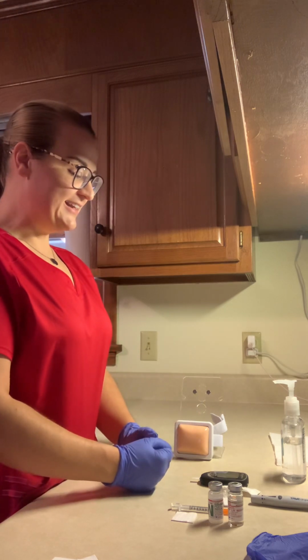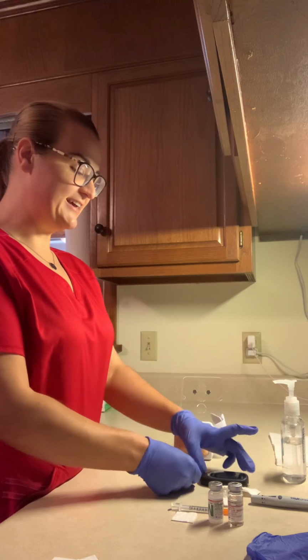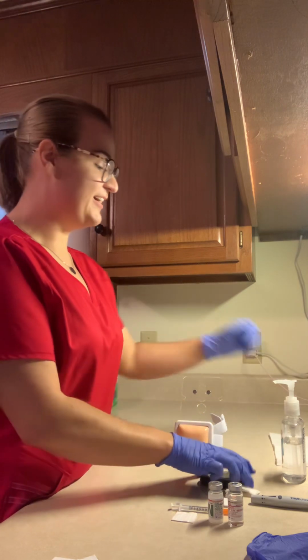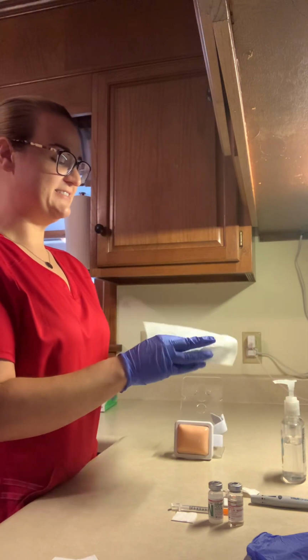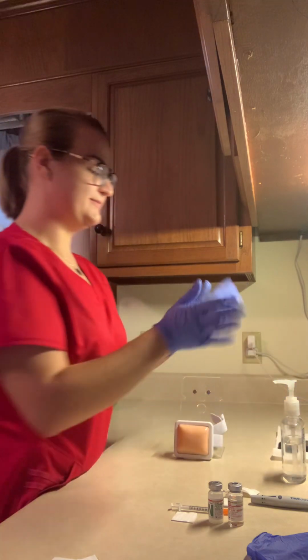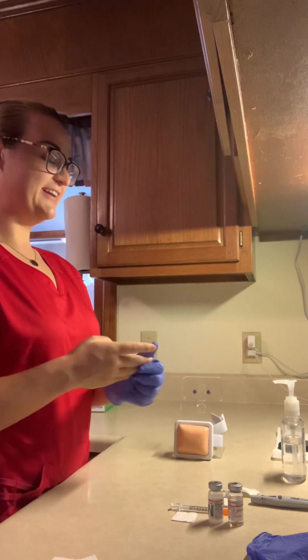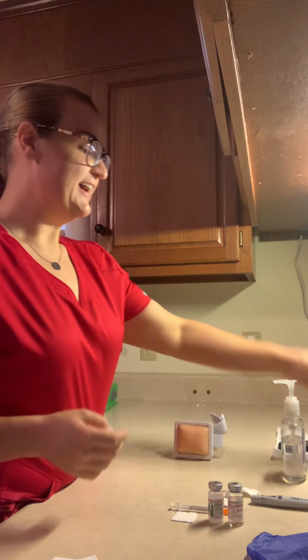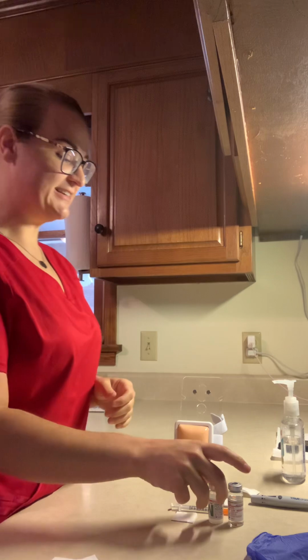So now that it is reading, it is red, your blood sugar is 210, so I'm going to take this out and turn the machine off and sanitize it while it is being cleaned and drying per disinfectant protocol. I'll take my gloves off and explain to Mr. Johnson, you do have to get a shot of insulin today. I'm going to clean my hands again and get started on his insulin.